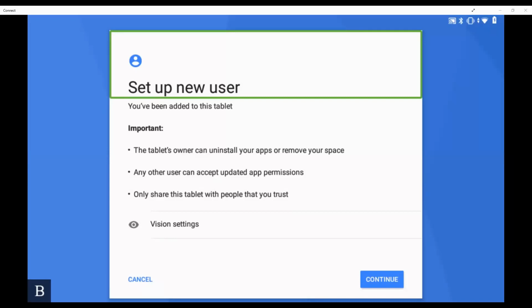What I did there is just went through the wizard, and you can navigate to the continue and next button at this stage. I just selected do not start the wizard each time I restart the Touch, and then I just exit the tutorial. So at this stage, you notice the voice is now changed. I'm now using Graham. So I'm currently old school Andrew.